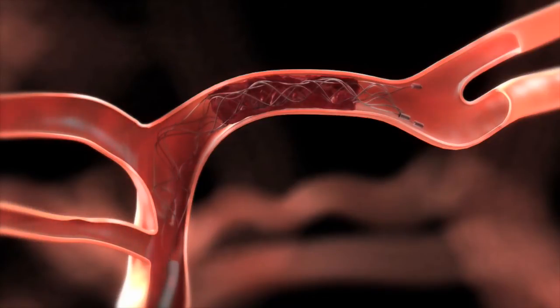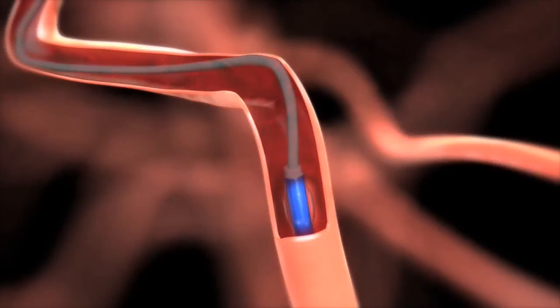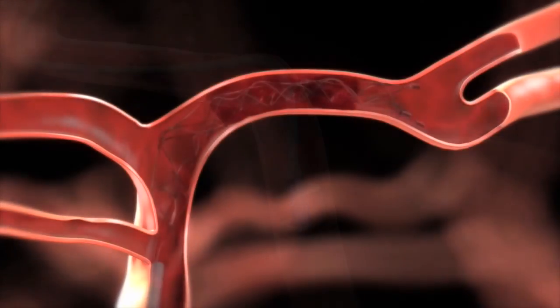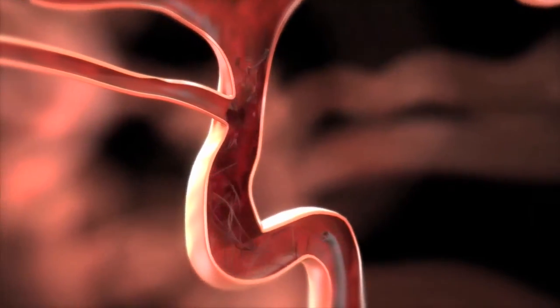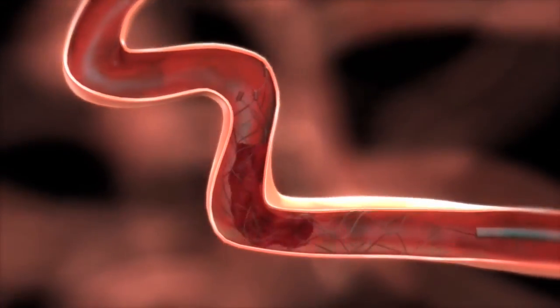After the five minutes is over, we inflate a balloon in the carotid artery in the neck, which arrests flow, and then we pull back the stent retriever device with the clot entangled inside it into that balloon catheter.